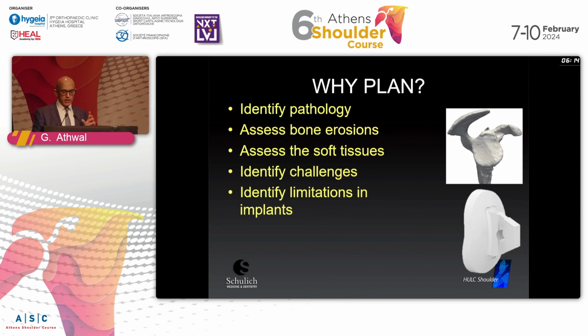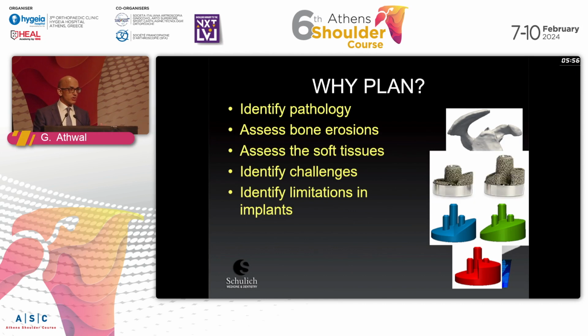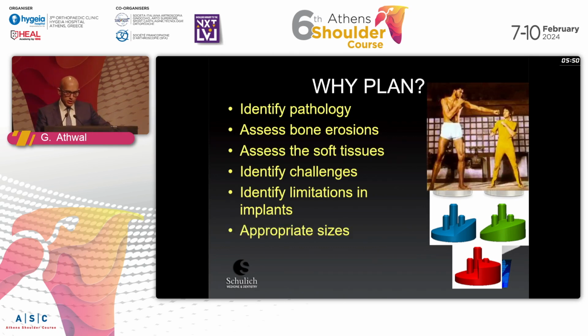And this is important. If all I had available to manage this patient was a standard glenoid, there's only one or two techniques I can do. I can just ream the high side all the way down, or I can put the implant in retroverted. If that's not something that falls into your philosophy on how to manage an anatomic total shoulder arthroplasty, you may choose to have augments available, or you may say, in this case, I'm going to go right to a reverse shoulder arthroplasty. So it allows you to certainly identify those limitations.